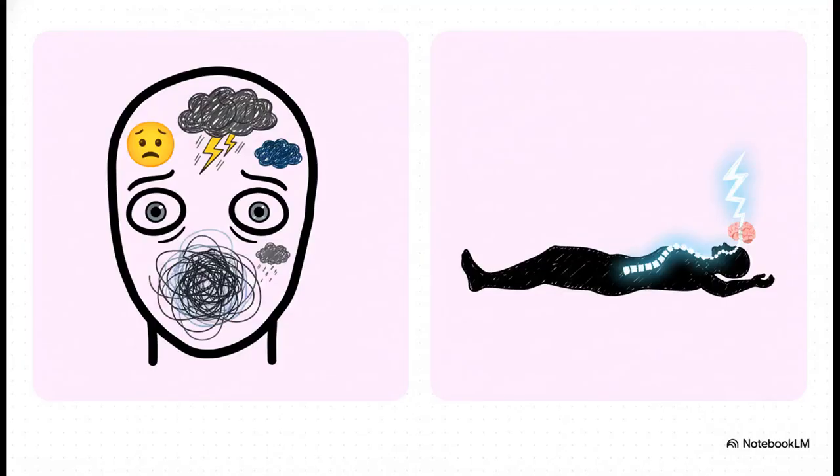Okay, first things first, we've got to be really clear on our terms. When our patients are under general anesthesia, we're not actually treating pain. Pain is a conscious experience, it's subjective, it's emotional. What we're managing is nociception. That's the raw, objective, physiological signal of a harmful stimulus, the electrical impulse shooting up the spinal cord that sets off a whole cascade of stress responses.